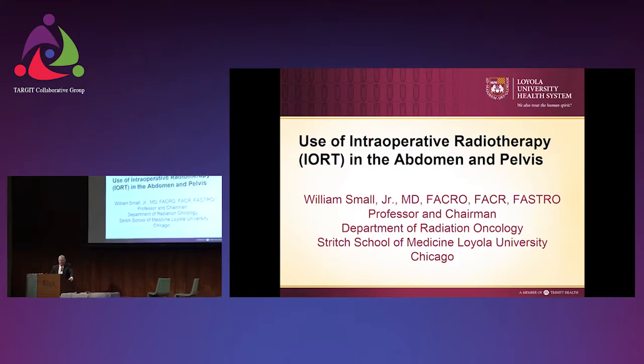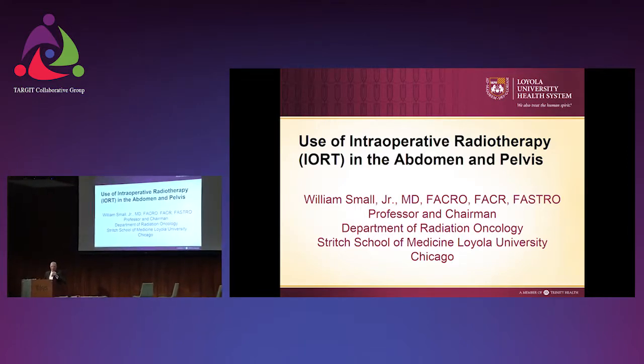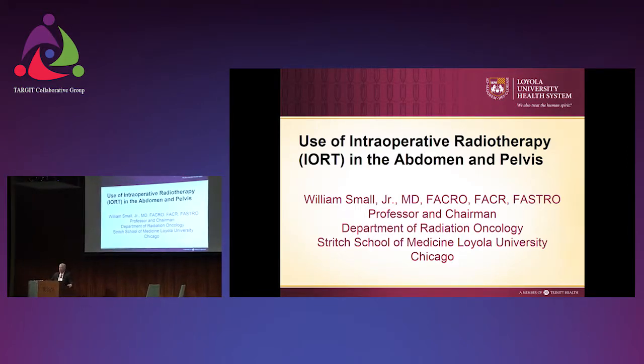I'll give an example. The last time I did pancreatic IORT at my last institution, we would take the patient open under anesthesia, roll them 4 blocks across into the basement, put the electron tube in, treat, and then the patient had a really bad bleed, and that was the last time we ever did it. So we don't do it because it's hard. It's practically hard to do.